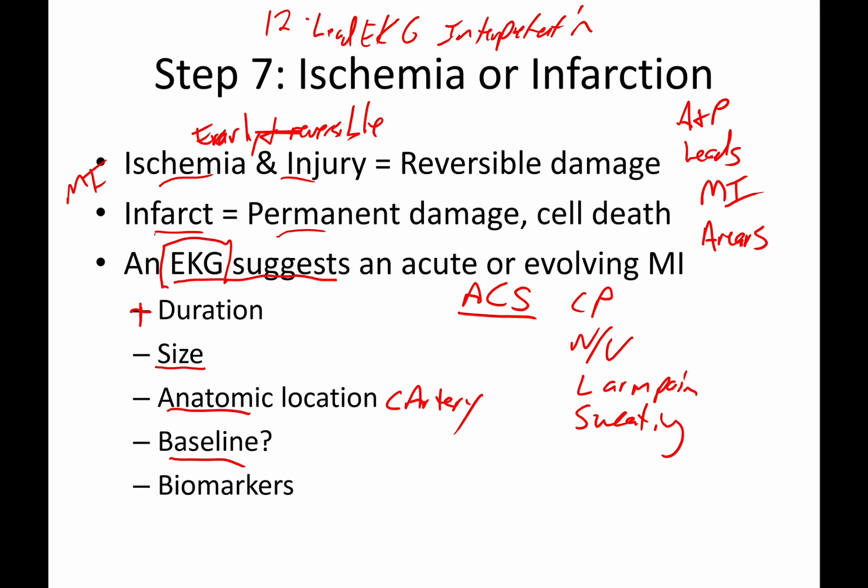And then combining with the EKG, you have to have the biomarkers, the troponin and the CKMB, which again comes back to duration, because if it's early enough, your biomarkers aren't going to be where they need to be. So EKG is just one part of the overall evaluation approach.